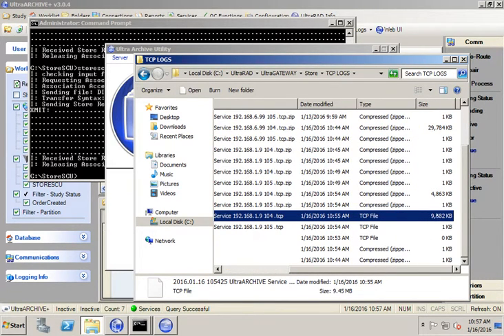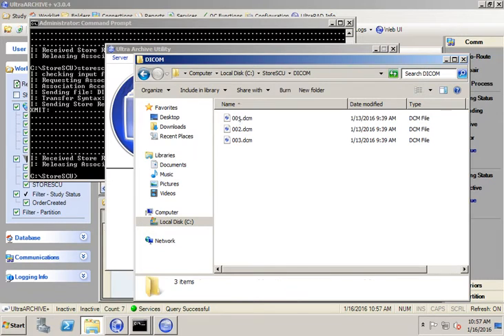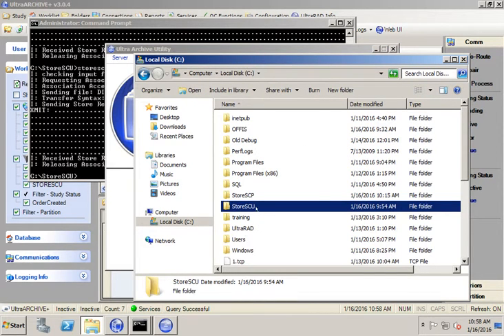Now notice that that log file is rather large. It's over 9 megabytes, and I've only had it running for a short period of time. The reason that log file is so large is that the file that I sent is about 9 megabytes, and I'll show you. So if I look in Store SCU, this is the file that I actually sent, and it's 9.6 megabytes. So it logged the entire DICOM file because the actual file is sent, and we're logging all of those packets. Everything, all that data is logged in the TCP log file. So they do grow rather quickly, and they are quite large, so we don't recommend running TCP logging for an extended period of time.